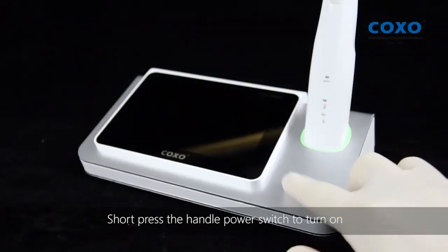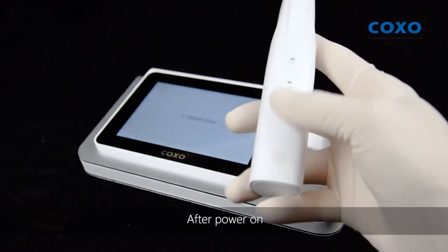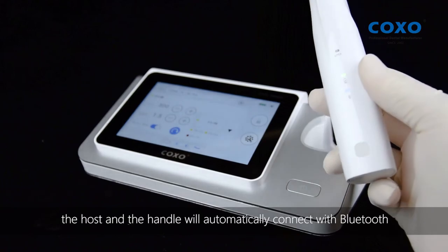Short press the host power switch to turn on, and short press the handle power switch to turn on. After power on, the host and the handle will automatically connect with Bluetooth.